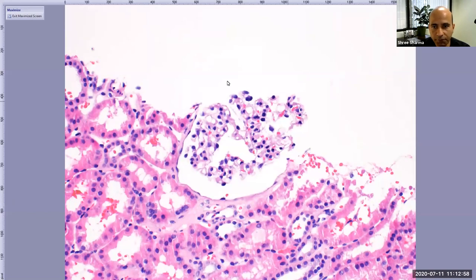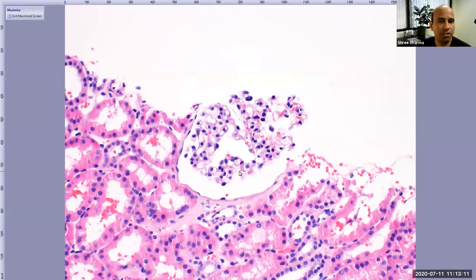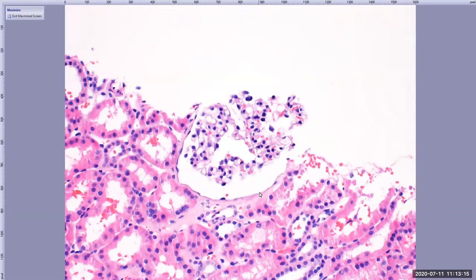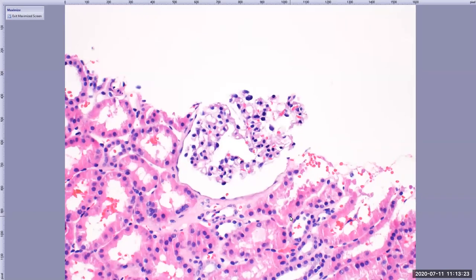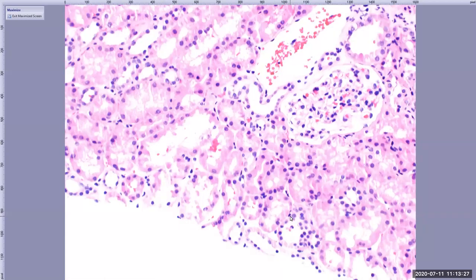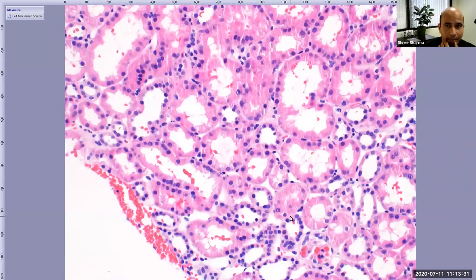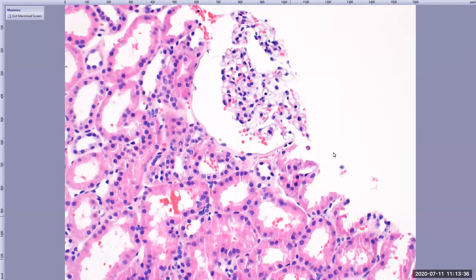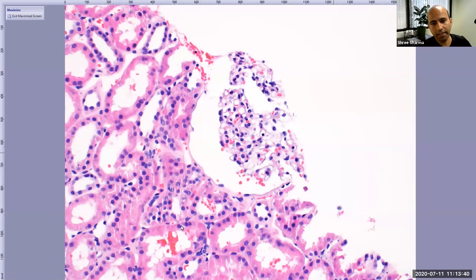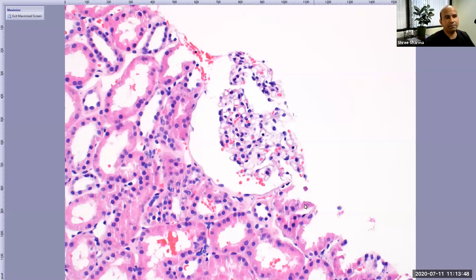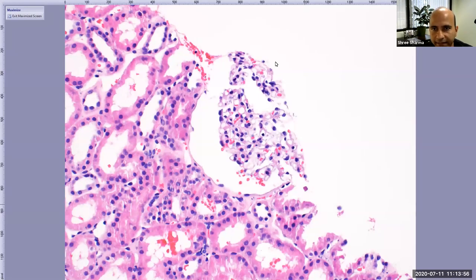To say this is normal, I first have to understand the different compartments of a glomerulus. There is a question about going for a glomerulus that is on the edge — ideally you want one in the center of the biopsy with no edge artifacts. But in a particular biopsy you don't have a choice; you interpret every glomerulus you get. Morphologically I can interpret even a peripheral glomerulus.